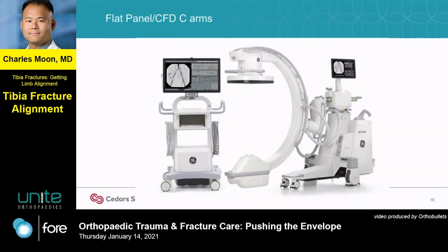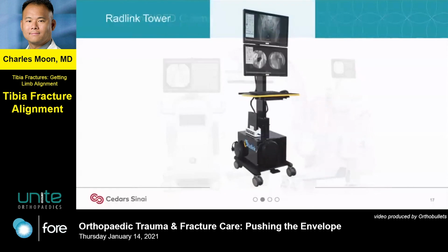I don't know if everyone's seen these or not, but these are very nice because you do not get parallax at the edges of these C-arms. It's hooked together with software, in this case RadLink. And full disclosure, this is one of the surgeons at our hospital's babies, one of our arthroplasty guys. And that's why we get to see all this interesting stuff that he comes out with.